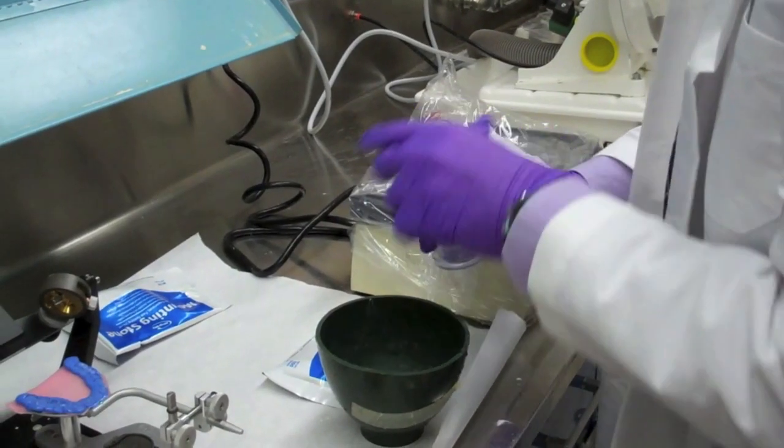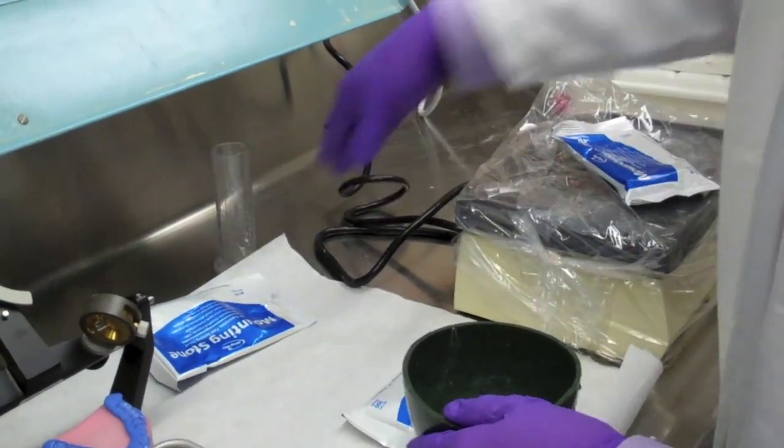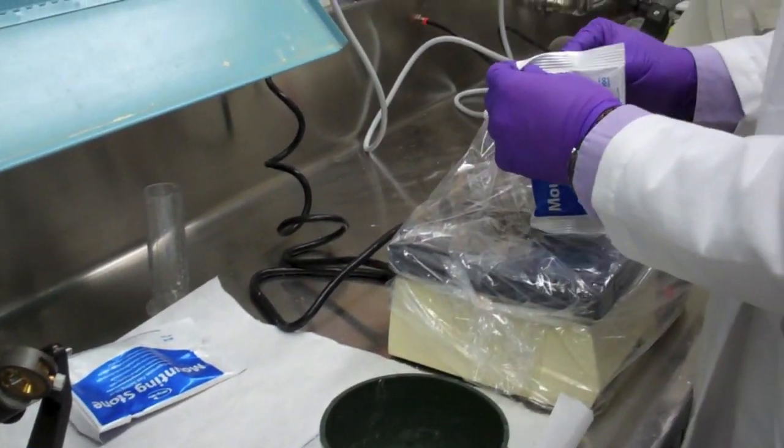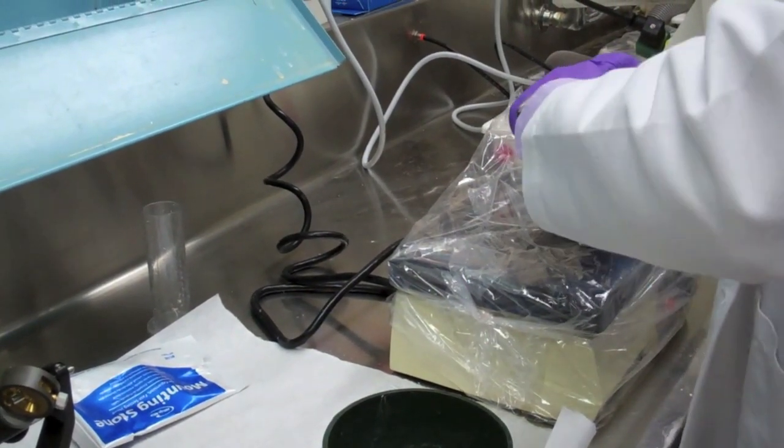First place 26 cc's of water into the rubber bowl. Directly following that, add the entire package of mounting stone. Note that each manufacturer is different and the water powder ratio will vary.